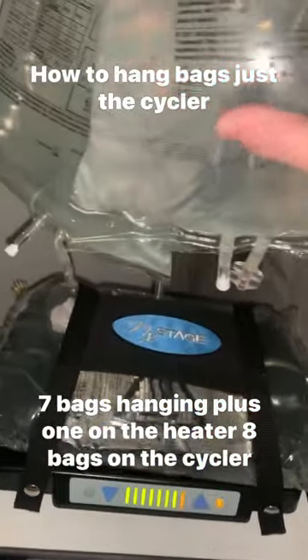And then I stack them on here. People have asked me how I get them all to fit, so I'm going to kind of show.